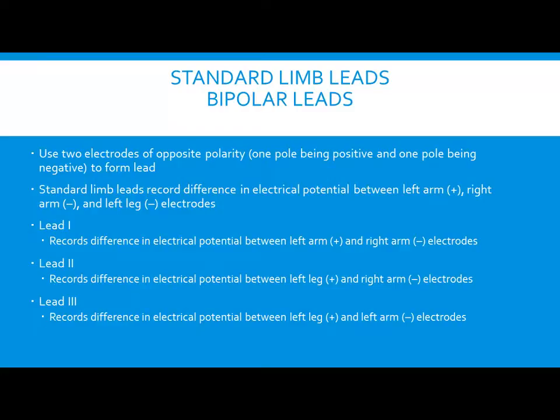All right, right shoulder or the right side. If you look on the white, it says RA or right arm. What's next? And if you look on it, it says LA or left arm. Then below, it's going to be red, or left leg.